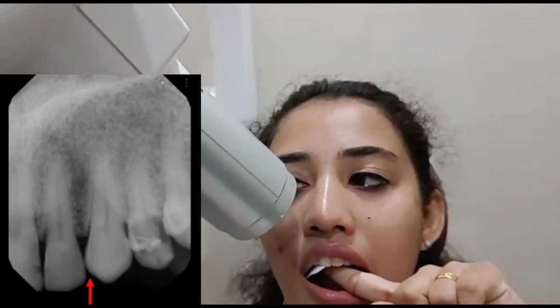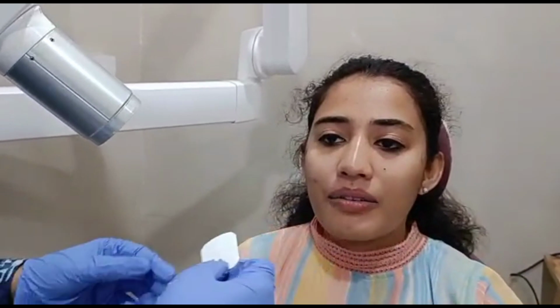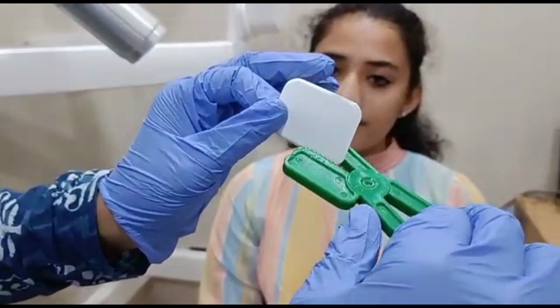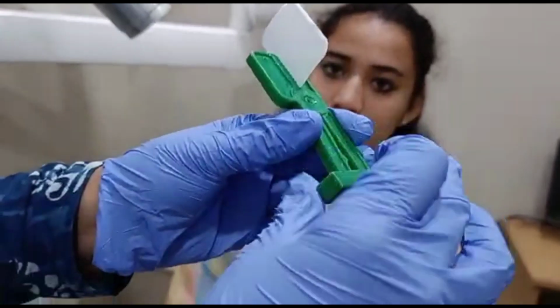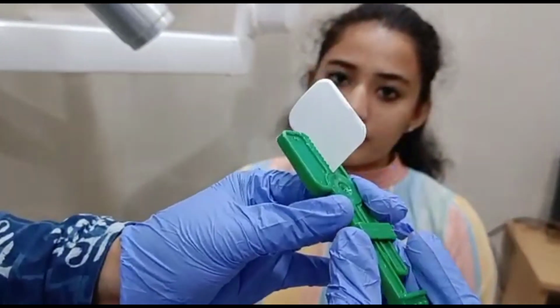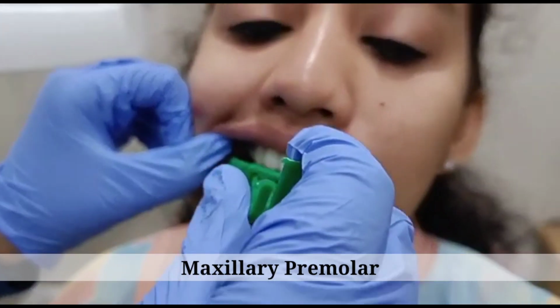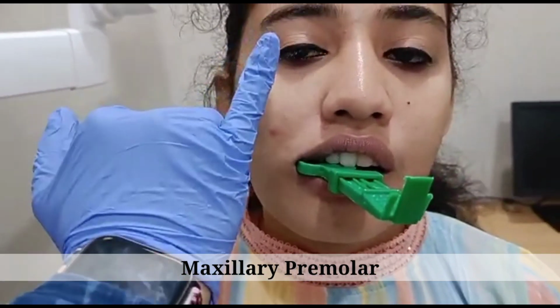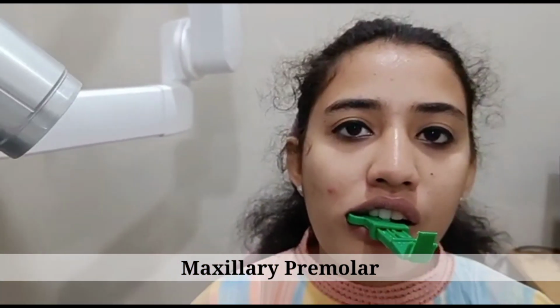So mainly we must know the vertical angulation that is supposed to be given for each of the radiographs. Next we are placing a snapray holder, and we are positioning and locking the holder such that we can take the projection for the maxillary premolars. The premolar to be taken should be placed in such a way that the image is in the center of the X-ray film, and then we place the receptor in such a way that the plane of the receptor is nearly parallel to the long axis of the premolar tooth.